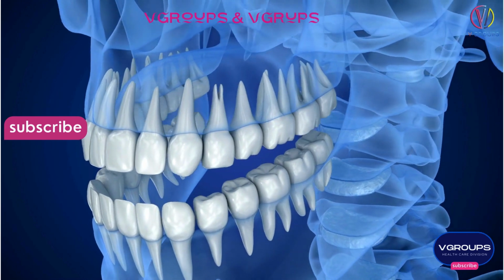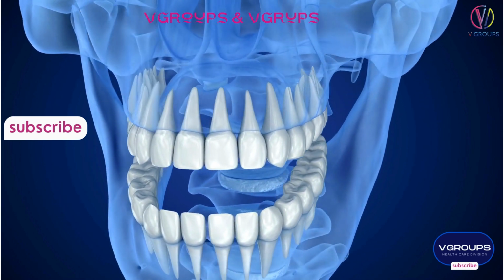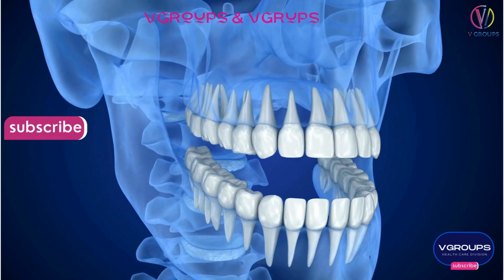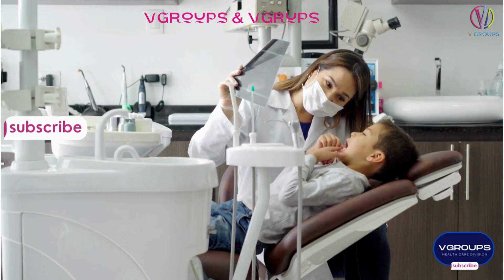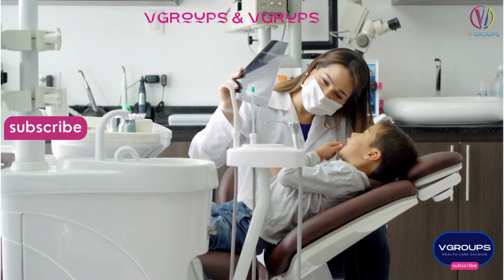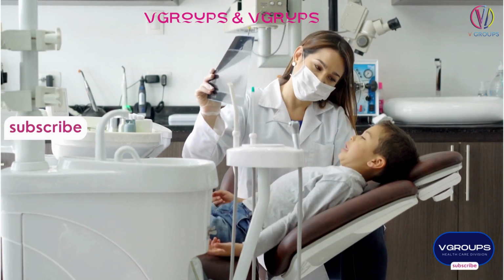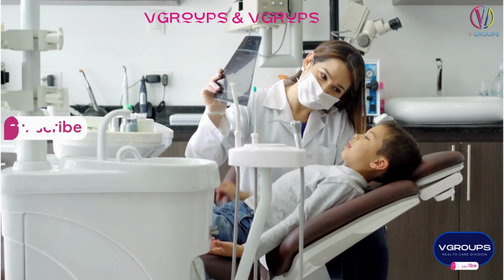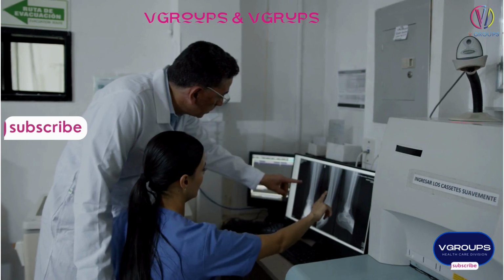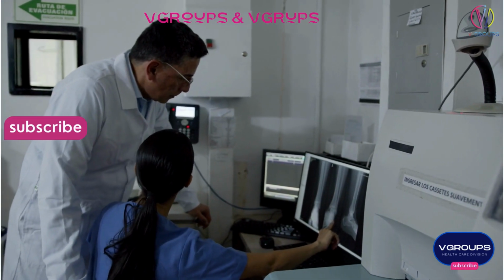Monitoring disease progression: follow-up X-rays are used to monitor the progression of the disease and evaluate the effectiveness of treatments. Changes in lung patterns seen on X-rays can inform healthcare providers about the evolving condition of the patient. Screening and triage: in some healthcare settings, X-rays are used for screening and triage purposes, helping healthcare providers quickly assess the lung status of individuals and prioritize those who may need urgent care.